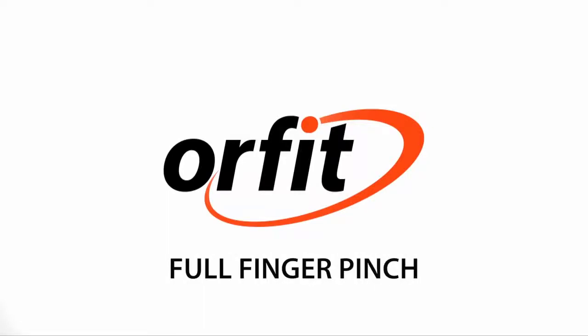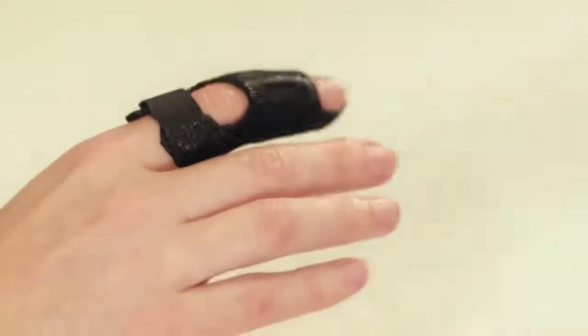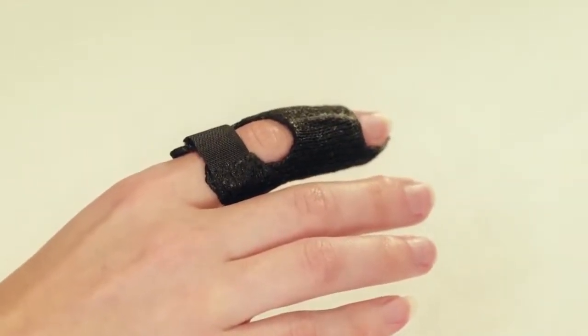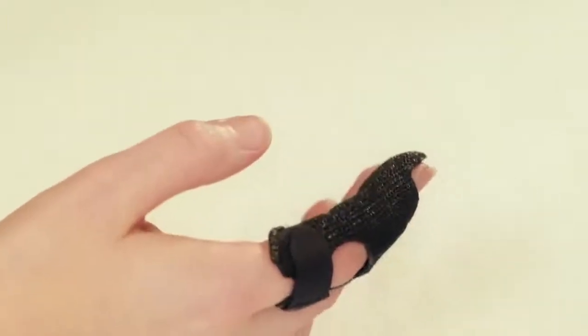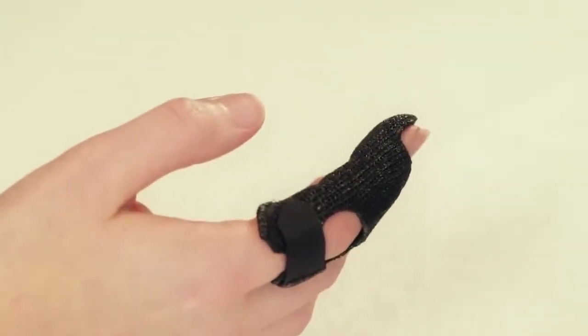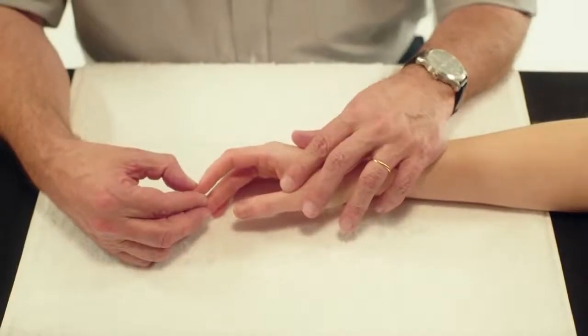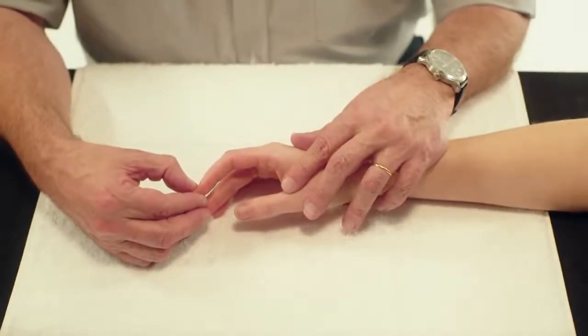Full finger pinch. Here we will demonstrate a full finger immobilization orthosis using the pinch method. The goal of this orthosis is to immobilize the finger in a resting position to help with pain management and edema control.